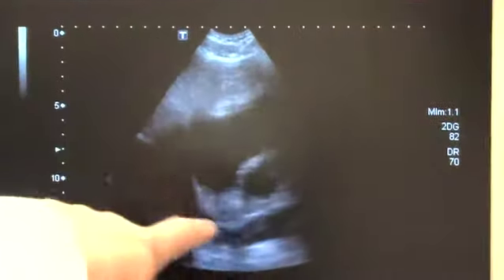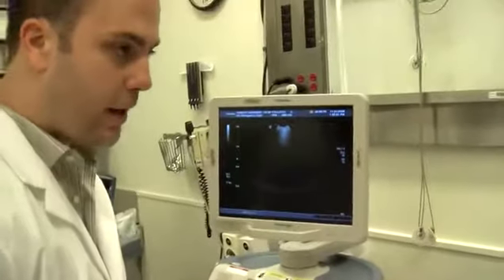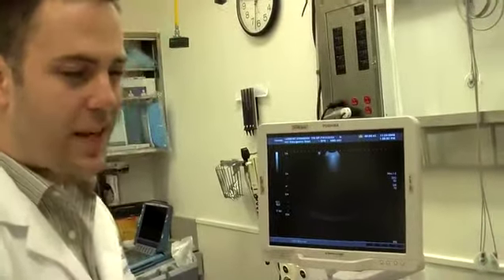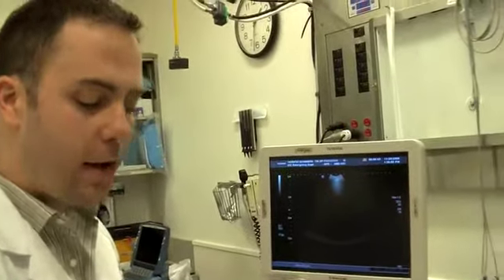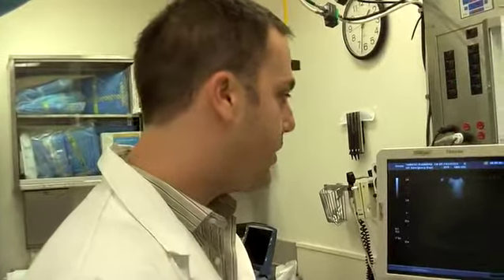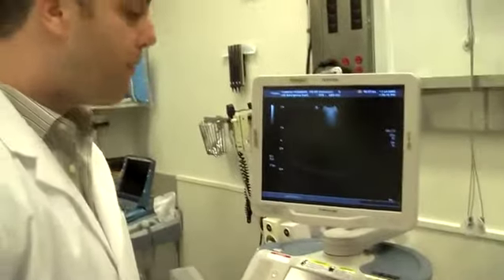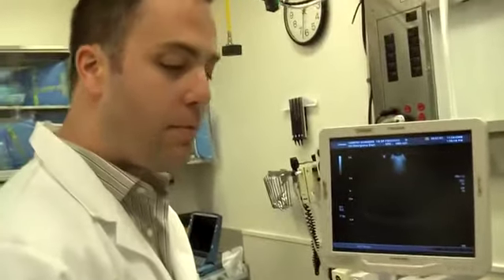So because you guys could see on that last subcostal view, it wasn't optimal. I couldn't really see the apex of the heart, and that wasn't because of operator error, because I'm really good at ultrasounds. It really has to do with some people just, especially in trauma patients, their anatomy is not always conducive to getting a good subcostal view of the heart. About 15% of the time, you're not going to get a great subcostal view. And that's why we've added another view, kind of the standard additional view in the FAST scan, called the parasternal long axis view. And patients who have poor subcostal views of the heart more than make up for it usually in the parasternal long axis view of the heart.